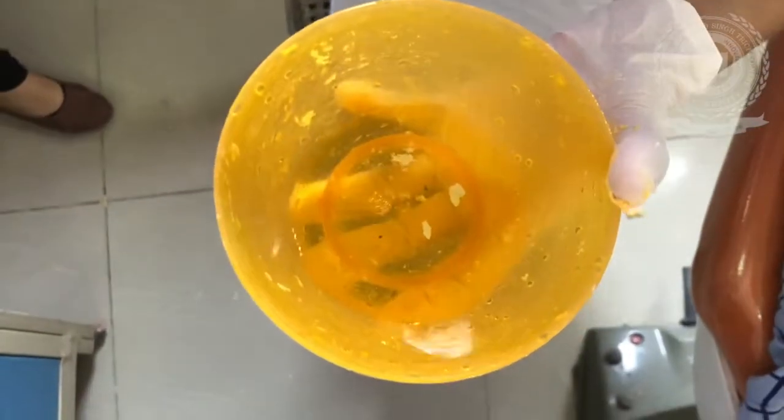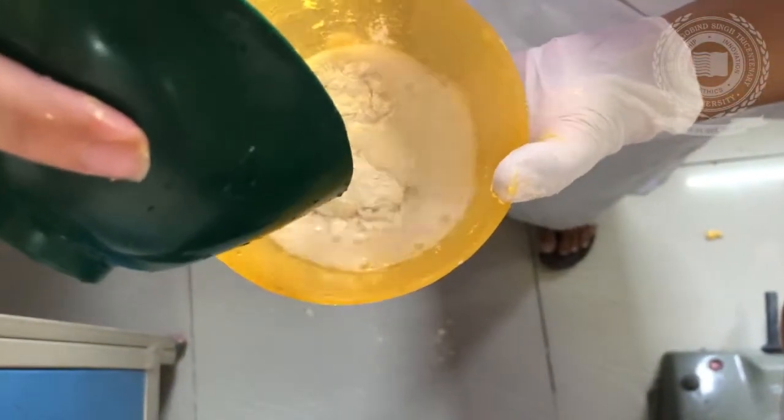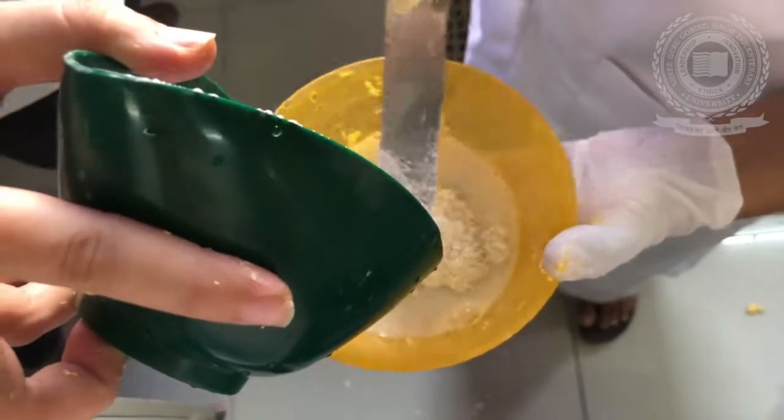Now we are going to mix dental stone — this is dental stone type 3 — and we are going to mix it.